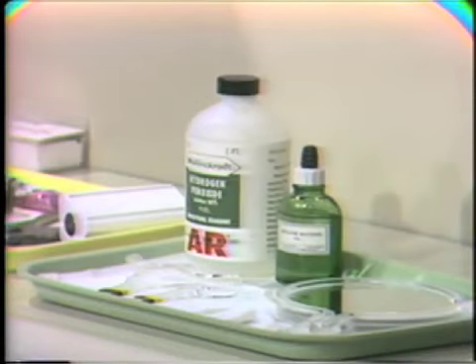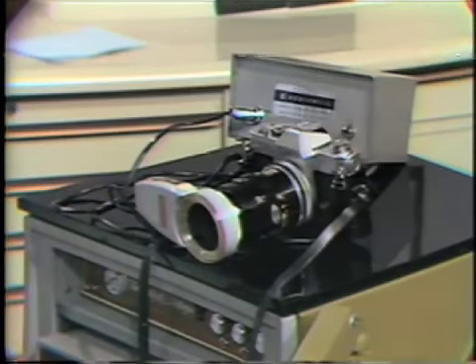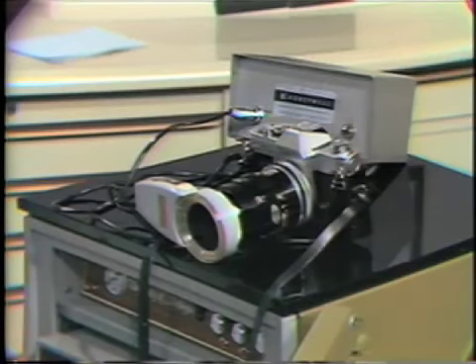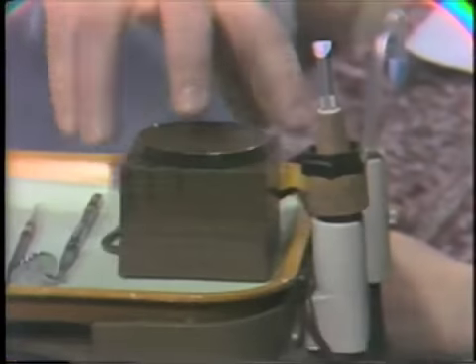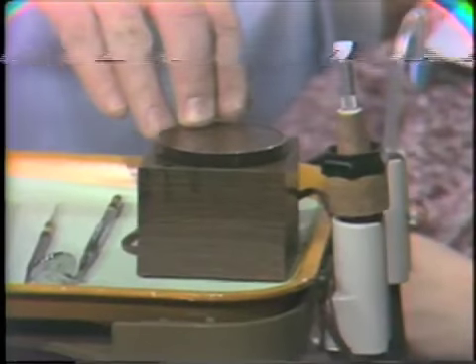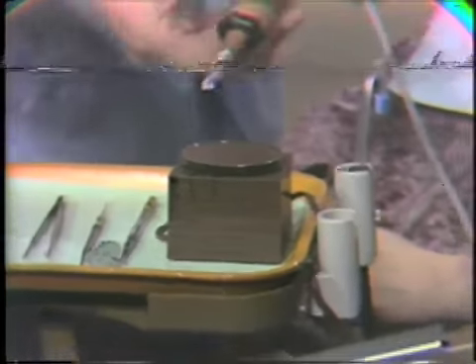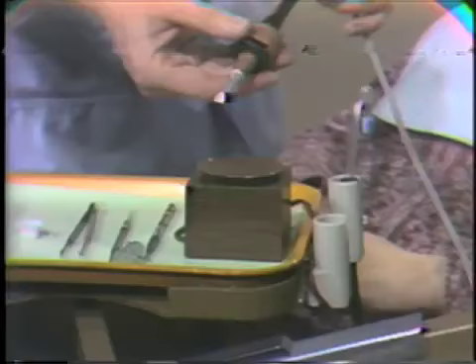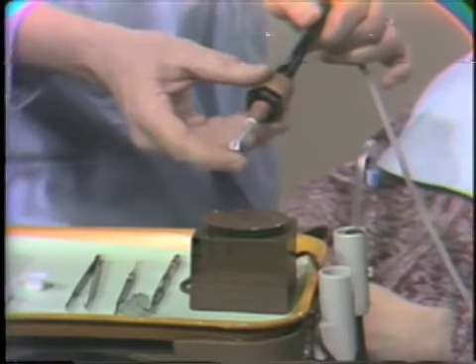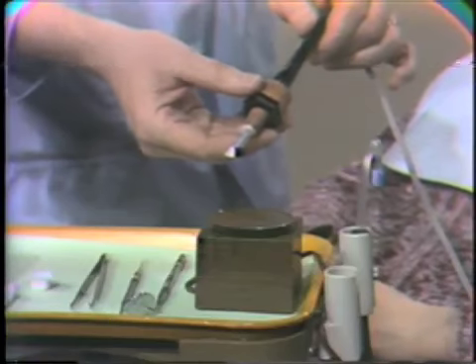It's good to have a good camera to pick up the results of our bleaching attempts, both before and after the procedure. And also, the most important part of the whole procedure is the bleaching tool itself. This happens to be a small rheostat which has been calibrated to allow us to get a certain temperature on the tip of just a normal hobby shop type of wood burning iron. We'd like to be able to calibrate this so that we can have temperatures somewhere between 100 and 160 degrees.